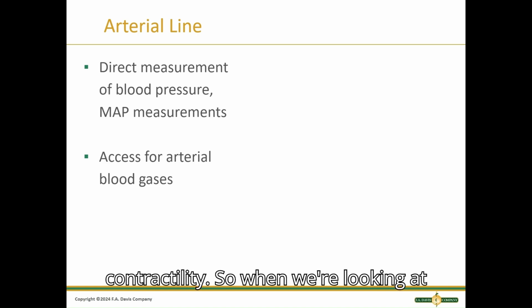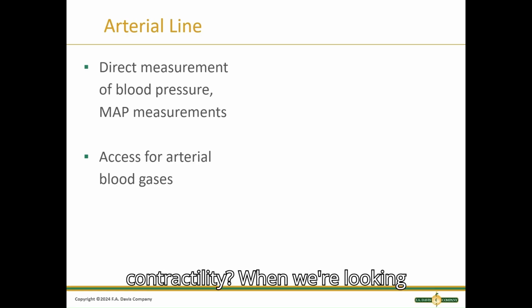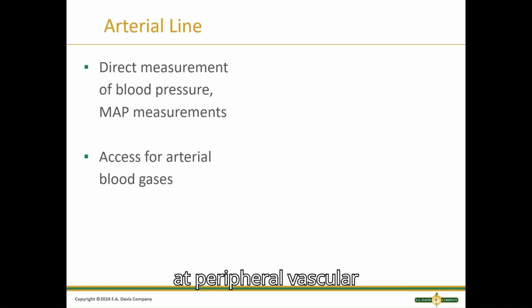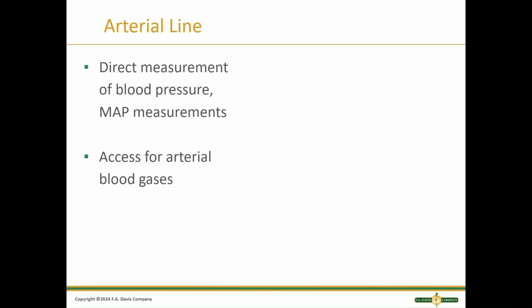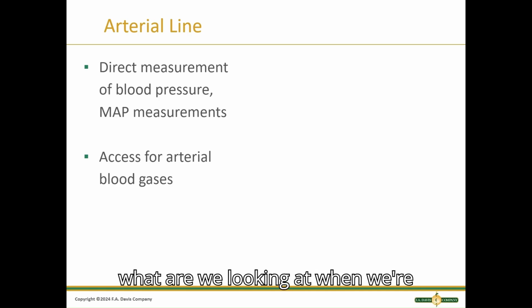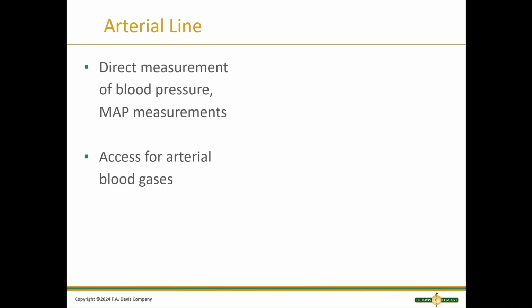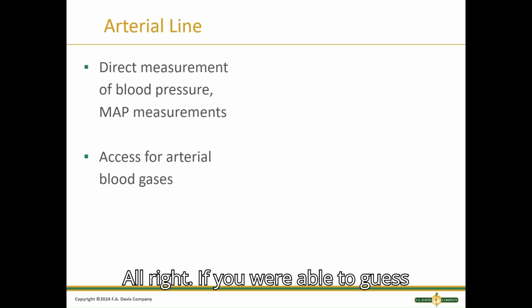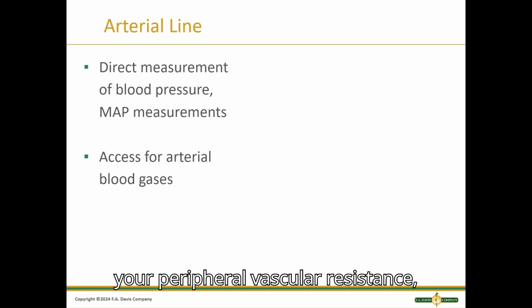Before we put an arterial line in, we're going to do an Allen's test, where we're looking at that radial artery to make sure there's adequate blood flow before we are going to be occluding one side. And again, we'll show you that in our labs. We're going to monitor for signs of infection, for bleeding, for hematoma at the site. Monitor our 5 Ps, especially when we're occluding an artery: pulse, pain, pallor, paresthesia, or paralysis. And if there's any disconnect or damage to it, patients can bleed quickly because it is an artery, so we want to make sure that we're monitoring those pretty quickly.